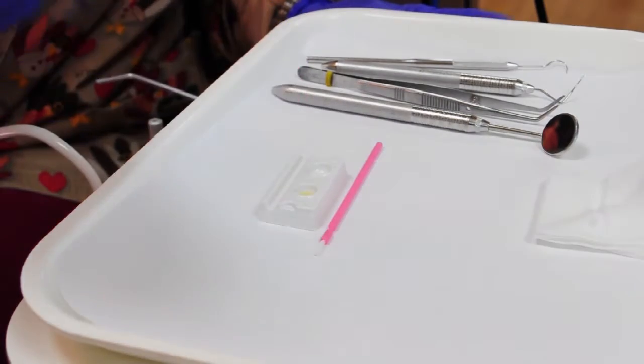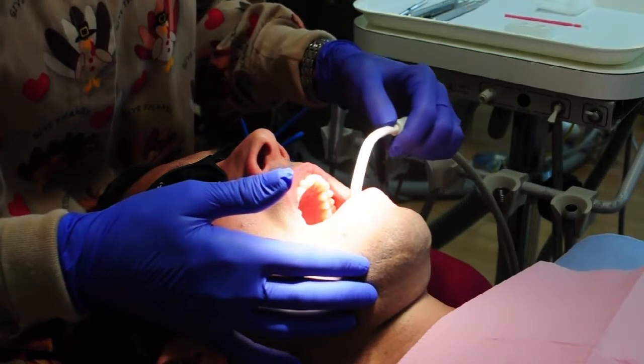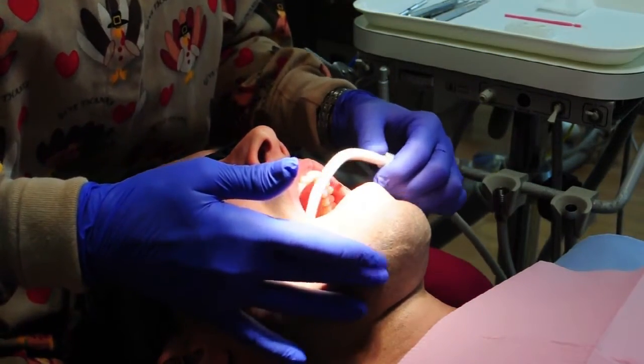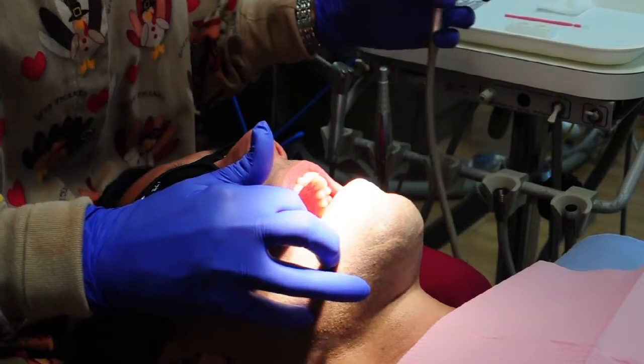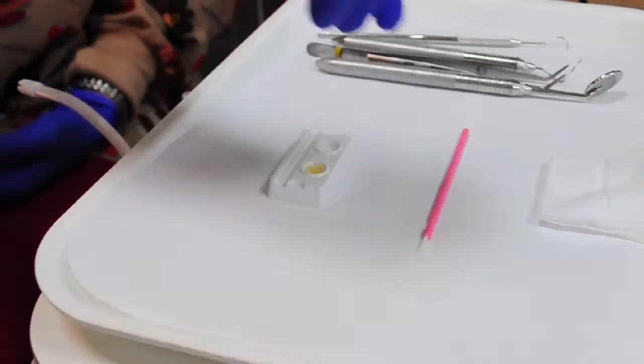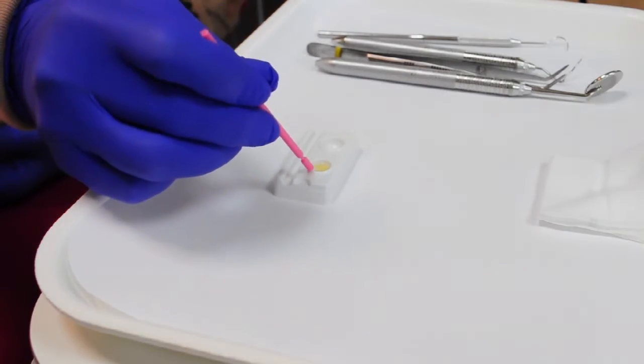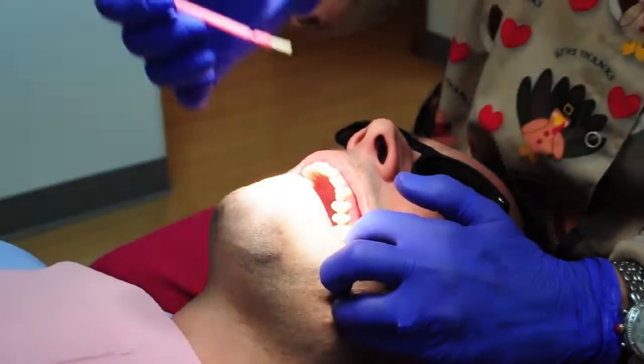Don't dry the teeth, but do evacuate pooled saliva. You want the dentition to be moist, since FluoriMax is thin and migrates on moist teeth. Wet the provided brush with FluoriMax. Retract the cheek, and starting on the back molar on the upper arch, deliver the therapy in a single swipe to the central. Again, because FluoriMax is thin and chases moisture, it will spread.